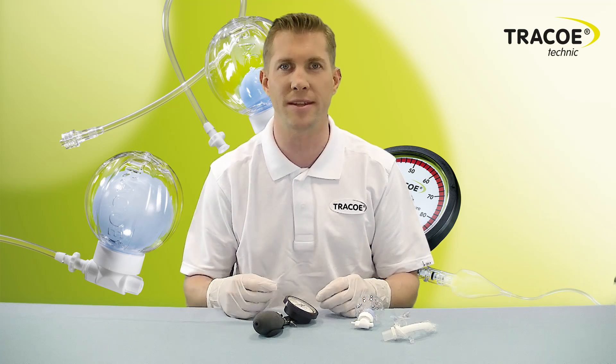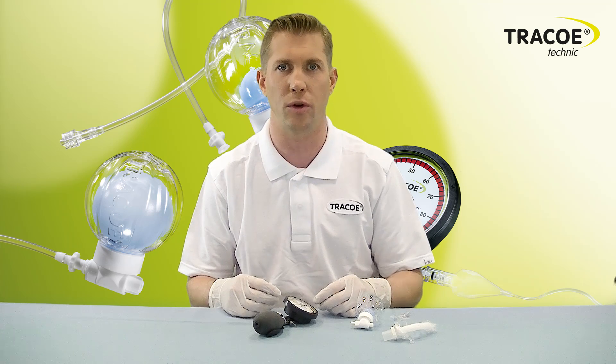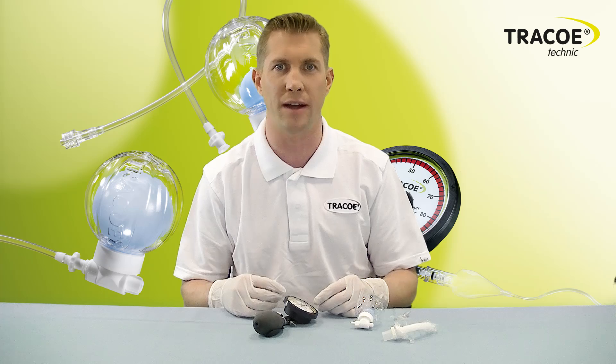The measuring of the cuff therefore merely represents a snapshot in time. It does not prevent too high or too low cuff pressures from occurring. The TracoSmart Cuff Manager, however, monitors and regulates the cuff pressure, thus avoiding aspiration of secretion and tissue damage.